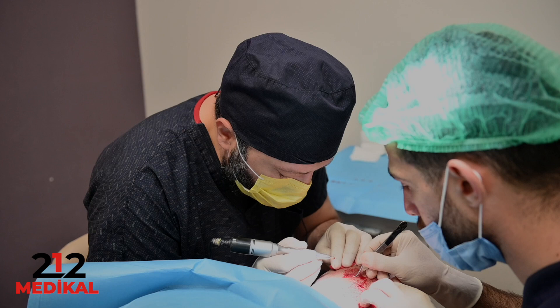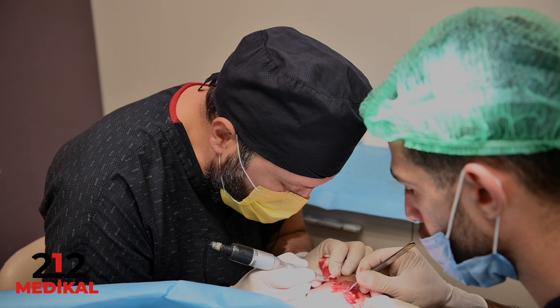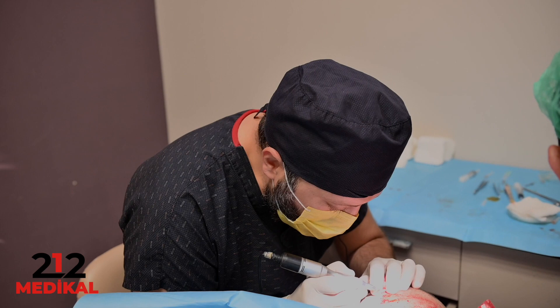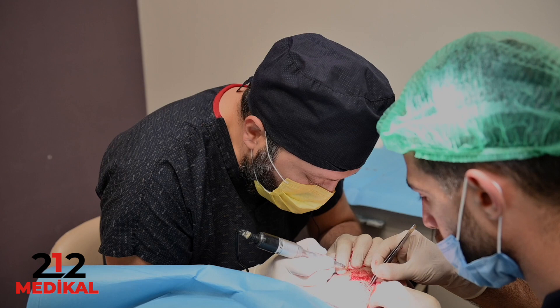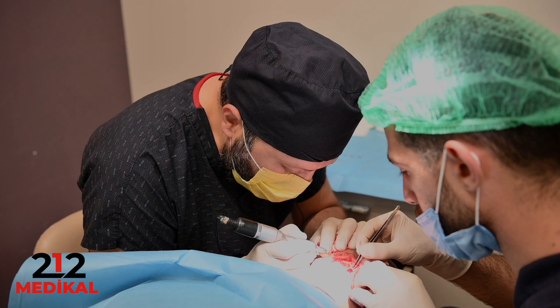In my clinic, I prefer to work with thin hairs. In that case, I generally use a 0.7mm diameter and 3mm length punch. If the patient's grafts or follicles are thick, I prefer the 0.8mm punch. Also, sometimes the grafts are very long, and in that case I generally use a 3.5mm punch so we can perform the extraction easily and safely.